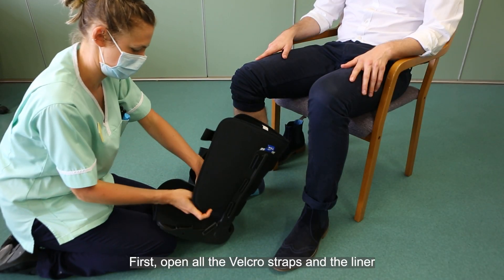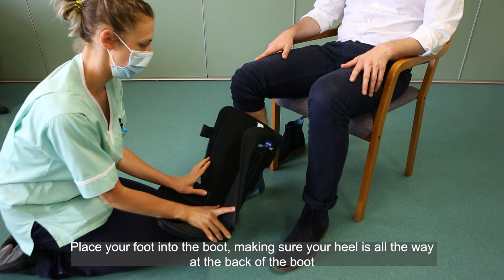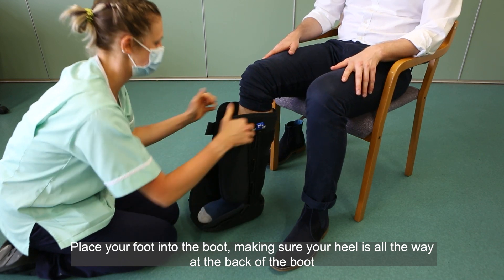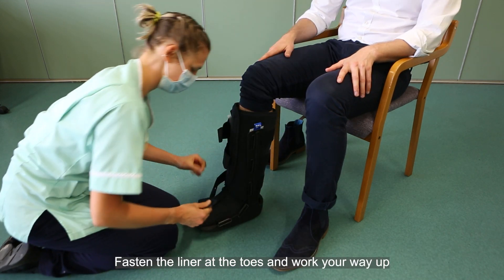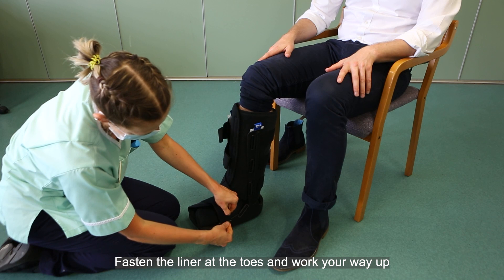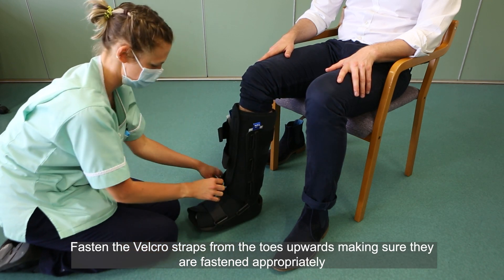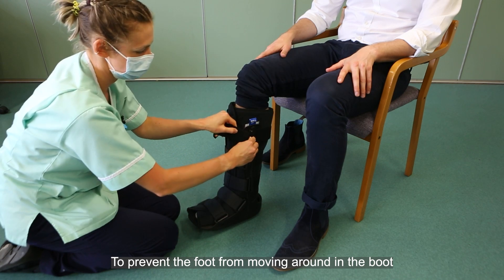First, open all the velcro straps and the liner. Place your foot into the boot, making sure your heel is all the way at the back of the boot. Fasten the liner at the toes and work your way up. Fasten the velcro straps from the toes upwards, making sure they are fastened appropriately to prevent the foot from moving around in the boot.